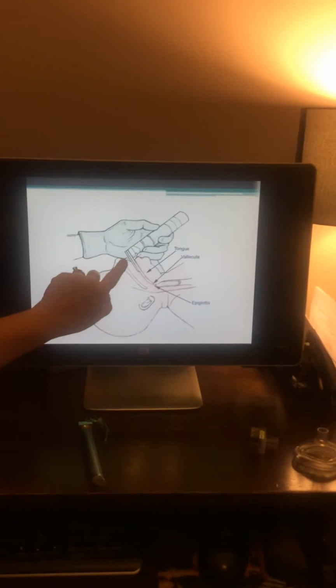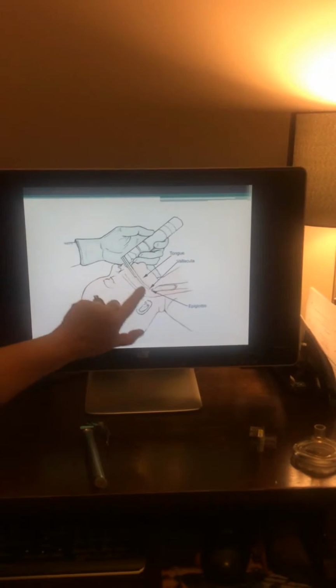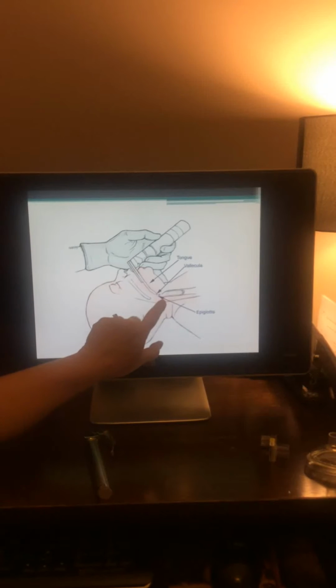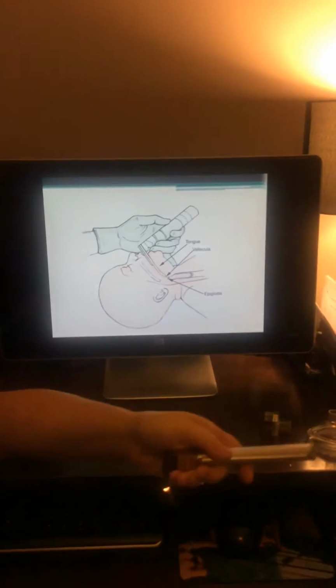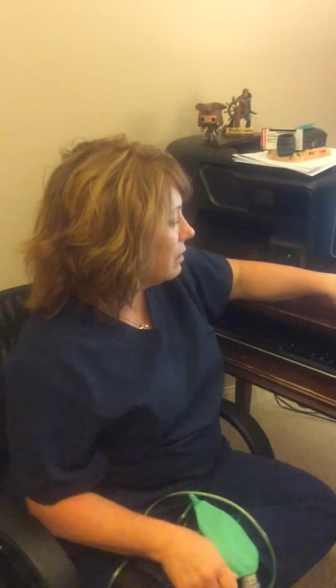You'll notice here's the lip. You want to stay off that lip. This is the straight blade. So you're going to go down, you're going to actually lift the epiglottis. If you had the Macintosh, you would go down in the vallecula and lift. But we're going to lift that epiglottis. You'll see here, we're kind of doing like a toast where you're going toward the corner. You don't want to do this rocking back motion because you're going to get right on that lip. You're going to cut the lip. If you have a little bit older baby in your emergency room that you're going to try to intubate, they may have a tooth or two, and you certainly don't want to knock any teeth out down into the airway.